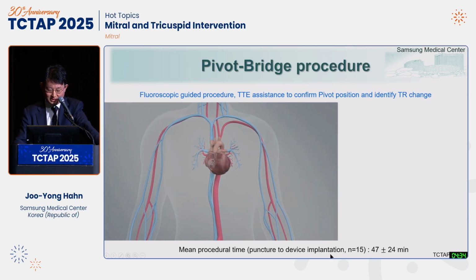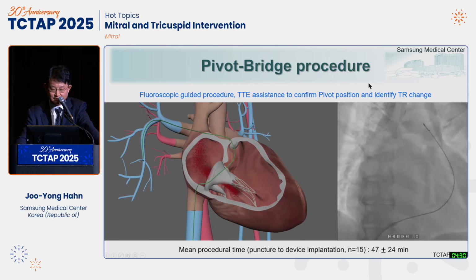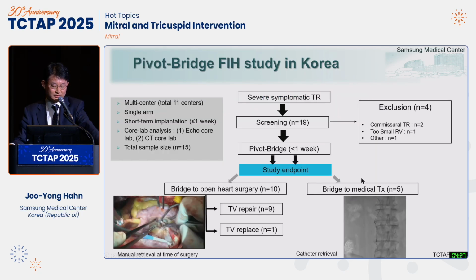In this study, the mean procedure time was 47 minutes, and all procedures were guided by fluoroscopy and TTE only.